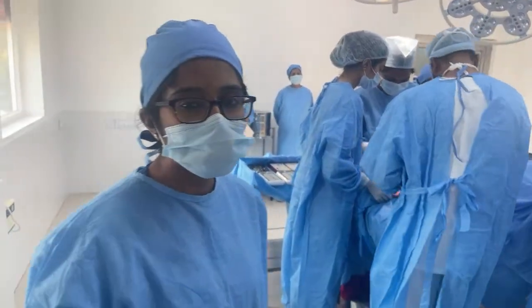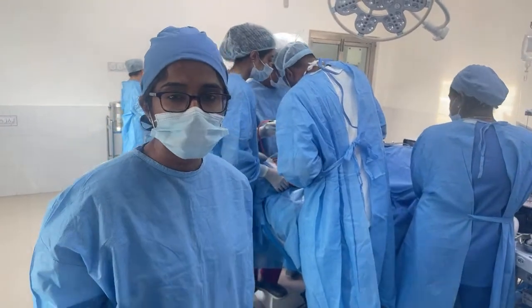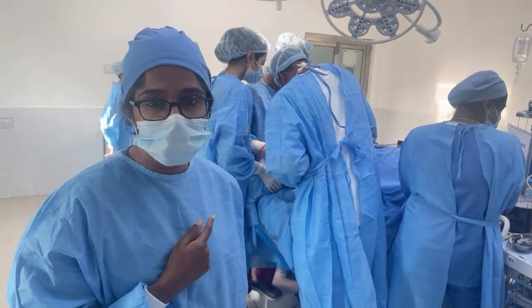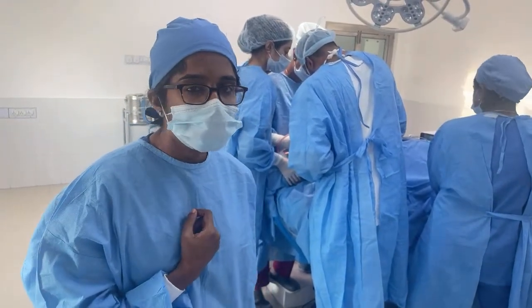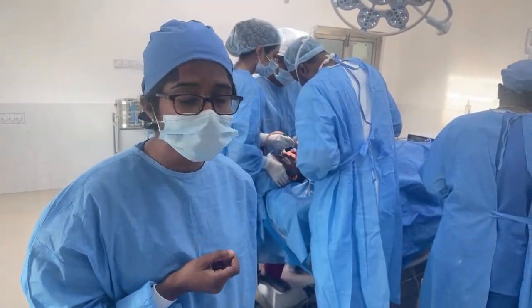So this procedure is called a genioplasty and jaw sculpting, as well as an angle osteoplasty. The sound that you hear is of a surgical saw that is being used to do some osseous manipulation.